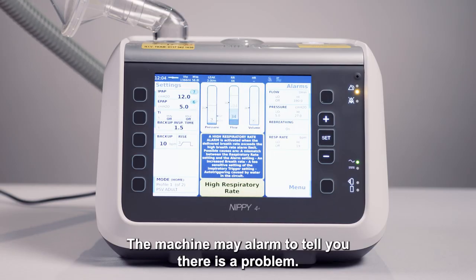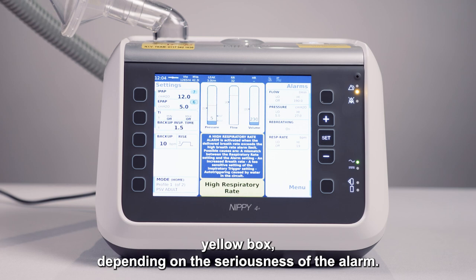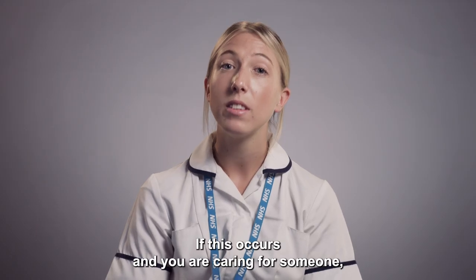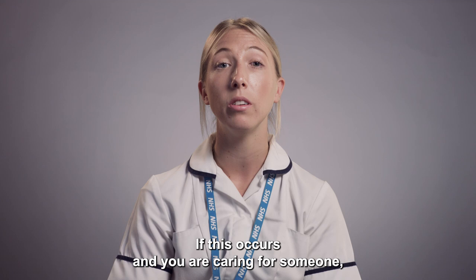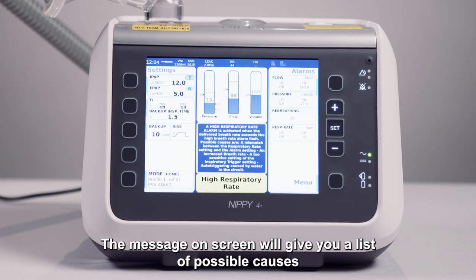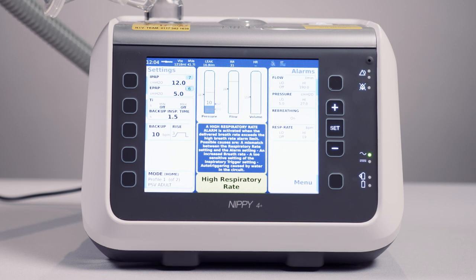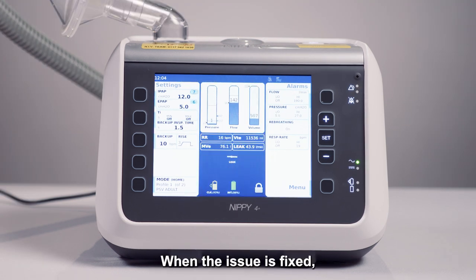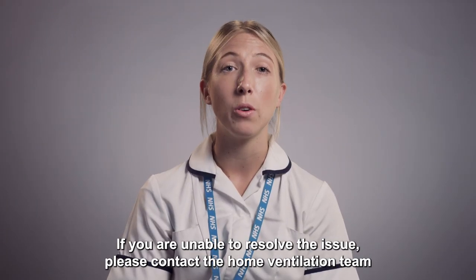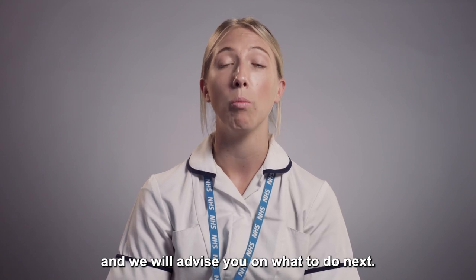The machine may alarm to tell you there is a problem. A message will appear on screen in a red or yellow box depending on the seriousness of the alarm. If this occurs and you are caring for someone, first check that they are okay. The message on screen will give you a list of possible causes and solutions to resolve the issue. When the issue is fixed, the device will self-cancel the alarm. If you are unable to resolve the issue, please contact the home ventilation team and we will advise you on what to do next.